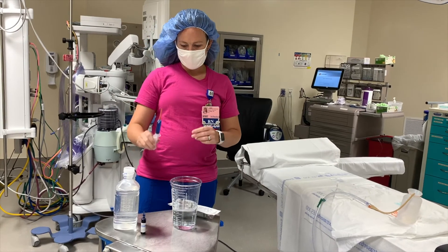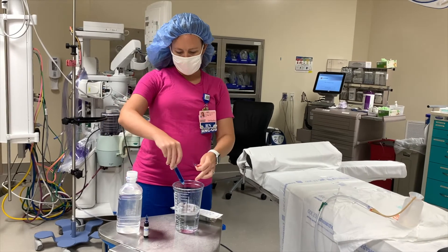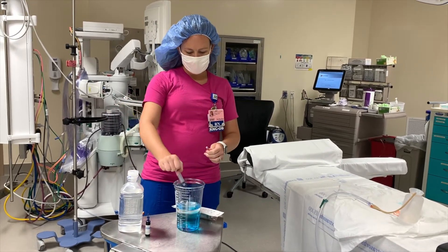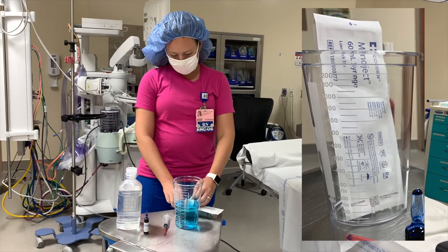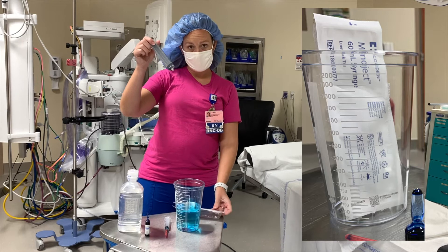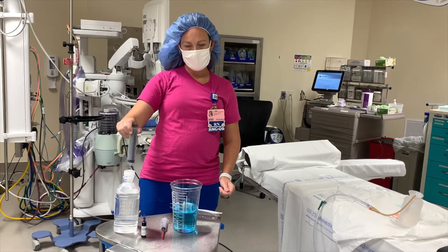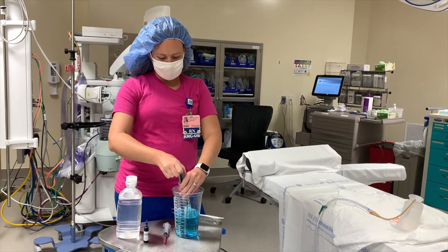You draw out your methylene blue and you're going to pour it into your sterile water in the suction container. The reason you're using a suction container is because this big 60ml syringe does not fit inside of the top of the sterile water bottle. So just make it easier on yourself and use the suction container.